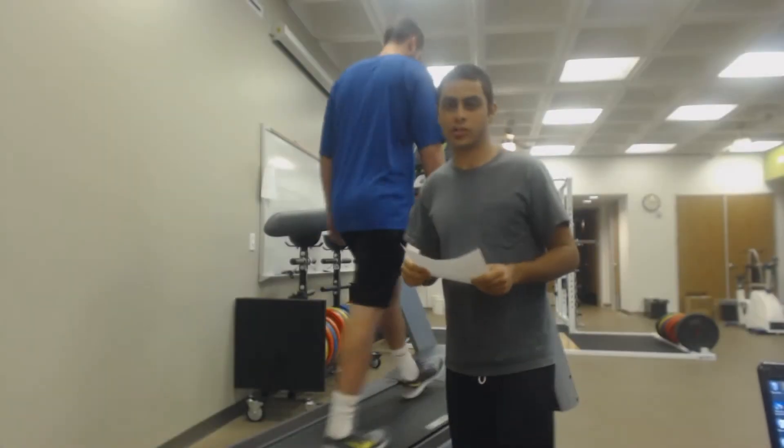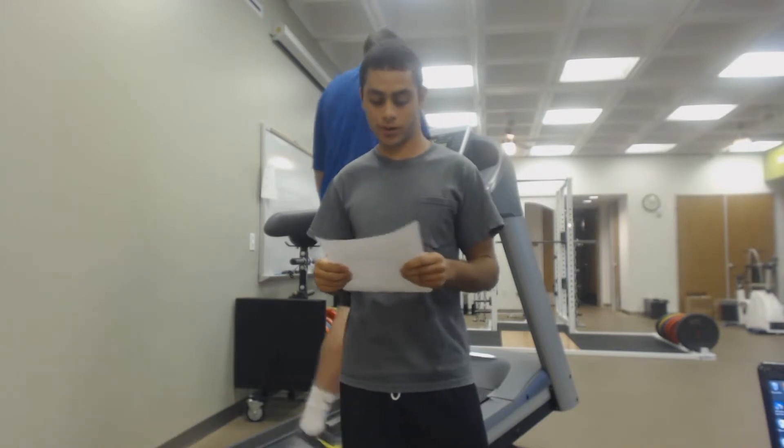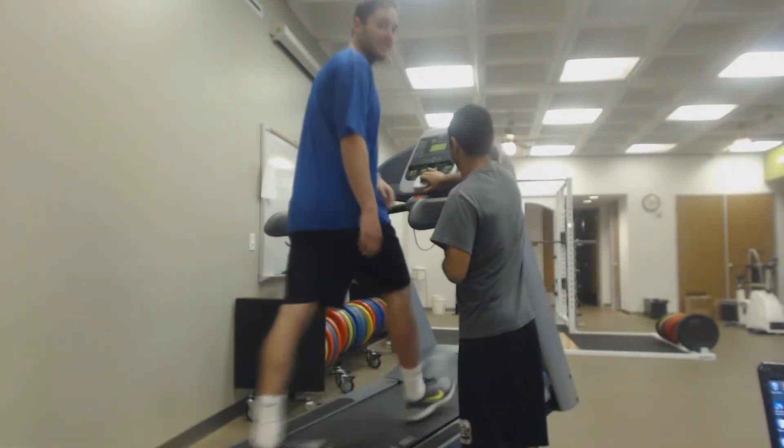Stage three: you're going 3.4 miles per hour at 14% grade. So now we're going to start stage three — he's going 3.4 miles per hour at 14% grade. My heart rate is now at 116.